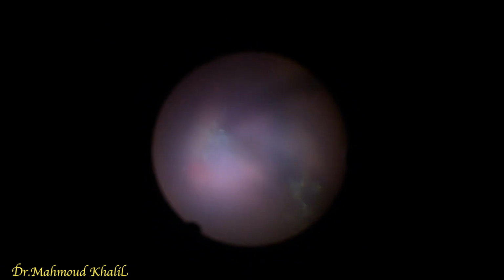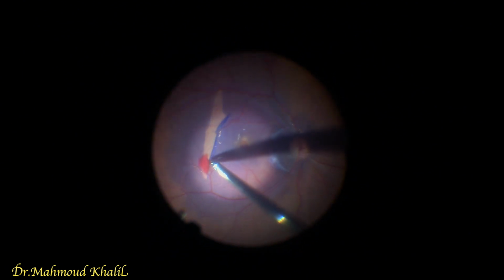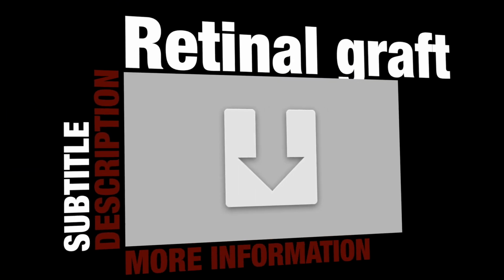The temporal part of the retina, the temporal part of the macula is the thinnest part of the macula, especially in high myopes, so we have to be cautious. Then the flap is covering the surface of the macular hole.